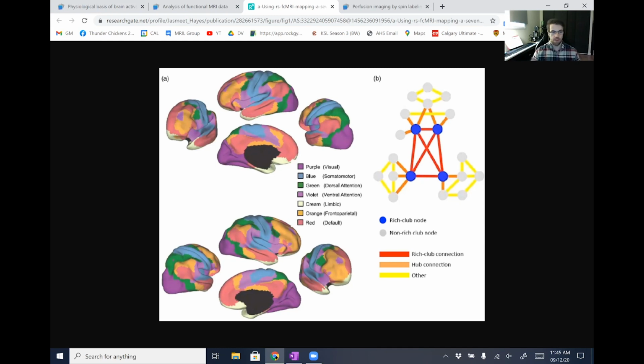So very, very interesting region of research, not my area of expertise, but my understanding, from the outside, is that this is the direction of fMRI research moving forward. And also there are a lot of different ways to do it, which is exactly how it is in diffusion-weighted imaging, which is my specialty. There's still tons of debate about what the right parameters for your scans are, what the right processing methods are, but essentially the general concept is let the brain do what it wants, see which regions have similar blood flow, and infer functional networks from there.